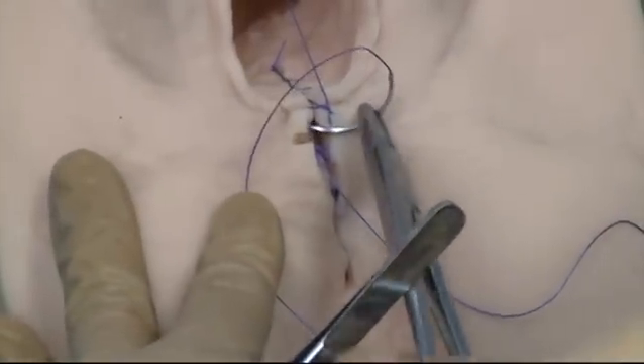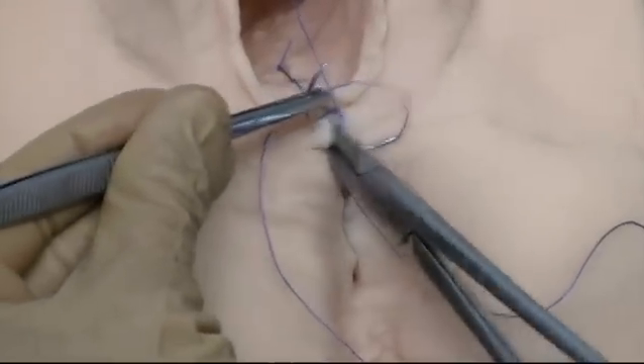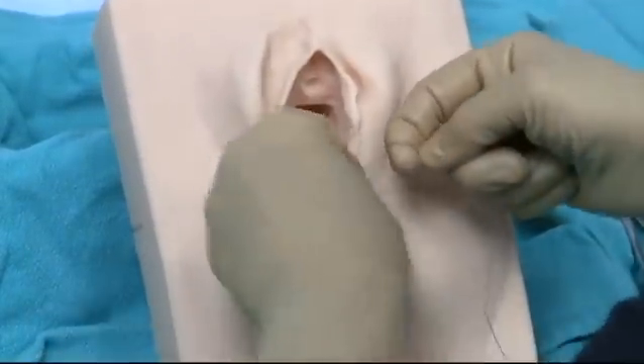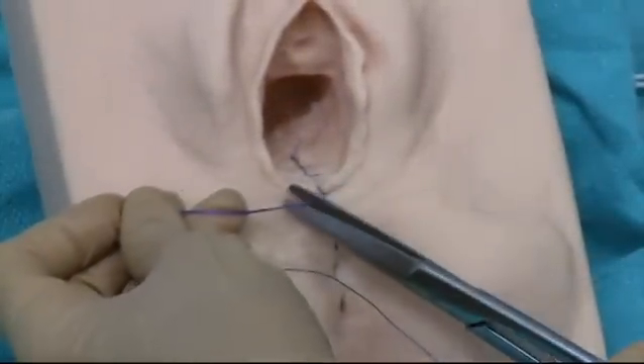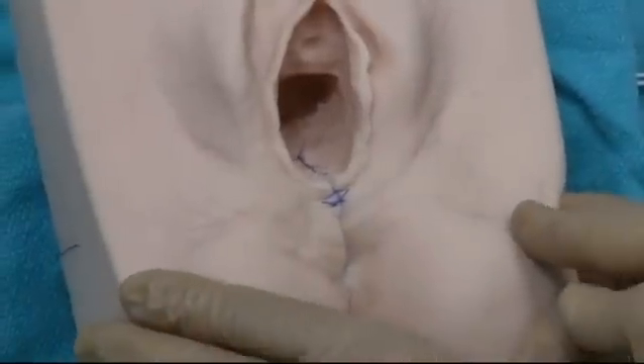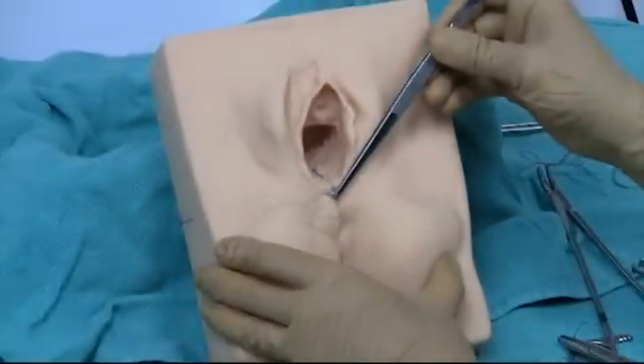Now that I've brought that subcutaneous tissue together I'm just going to come back out onto the perineum and tie off to the suture that we've already got. I usually throw a fourth knot here just to make sure it doesn't untie. The nice thing about this repair is that the knot is on the outside so the body doesn't have to dissolve it — though some women will find that the knot and that little bit of suture material is irritating.